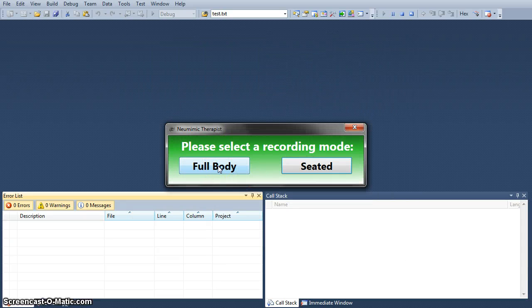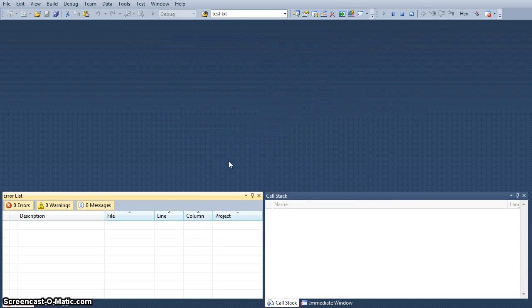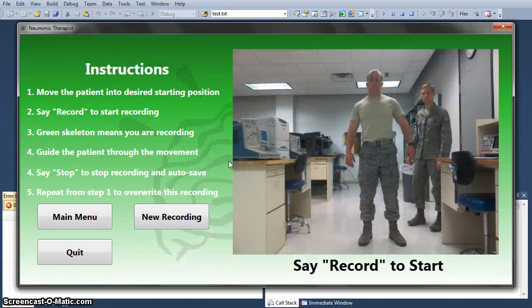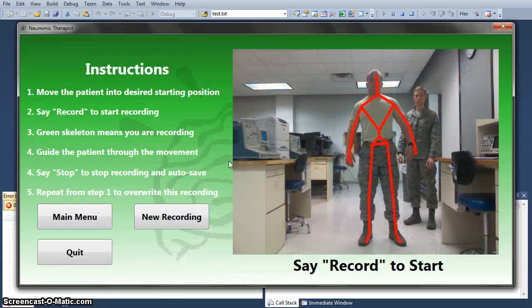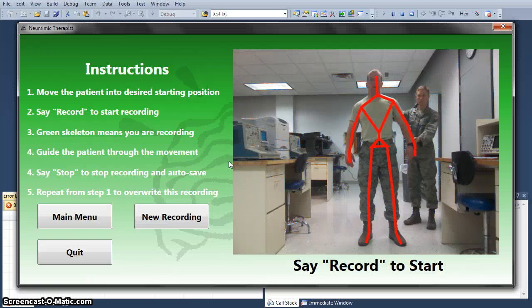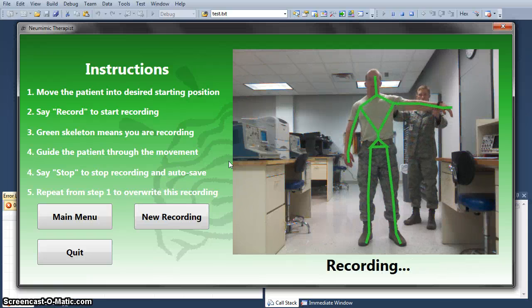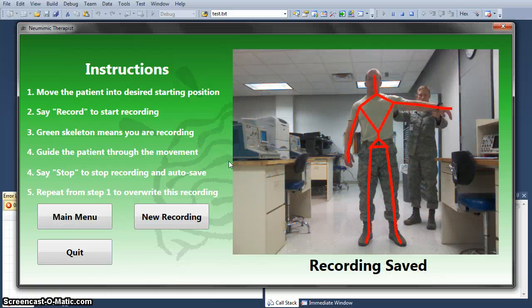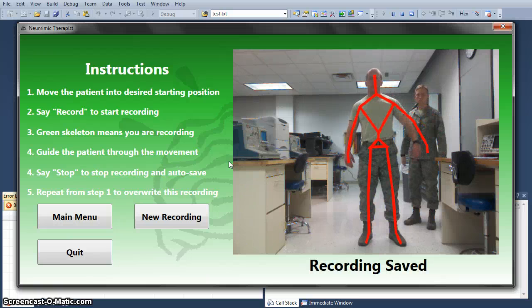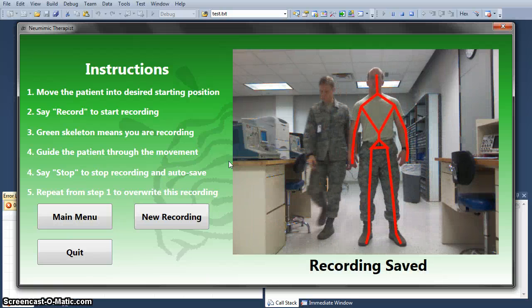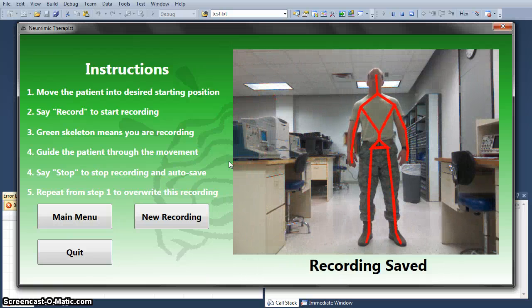We're going to do a full body exercise to demonstrate the full capability of the Kinect system. Record. Stop.